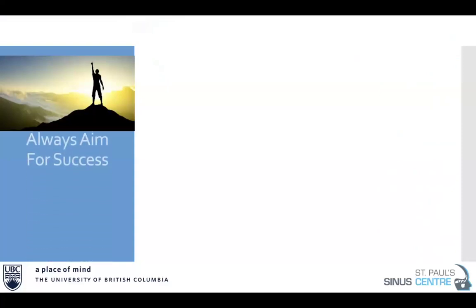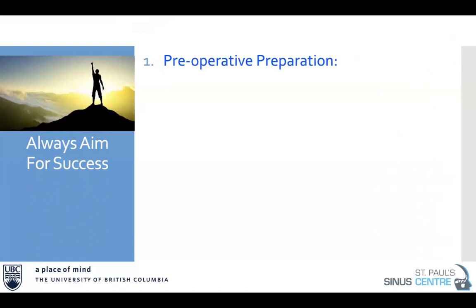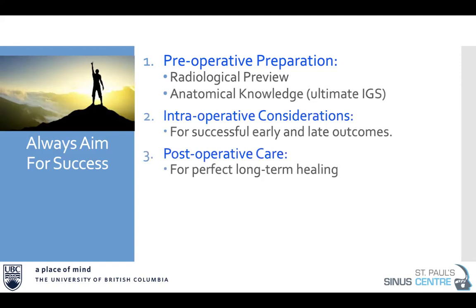So let's start about this talk. The first thing I always tell my students when I'm training them is always aim for success. And how do you do that in sinus surgery? Well, the first thing is preoperative preparation. And one of the first things in preoperative preparation is radiological preview. And this is extremely important.